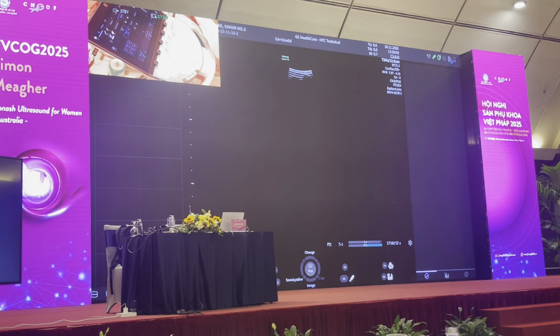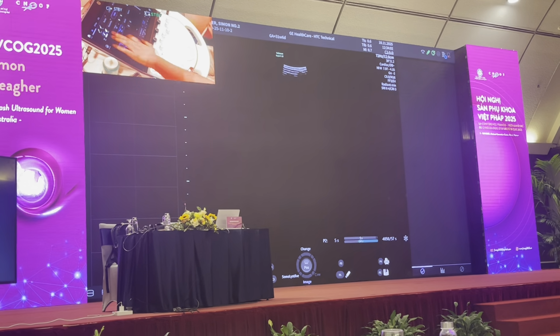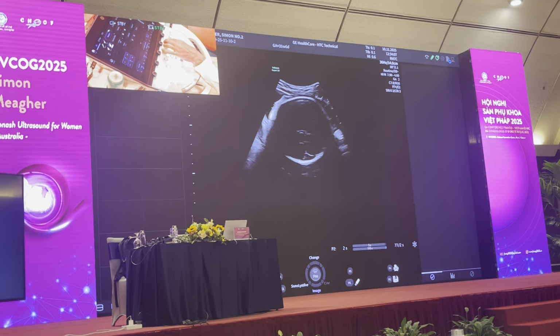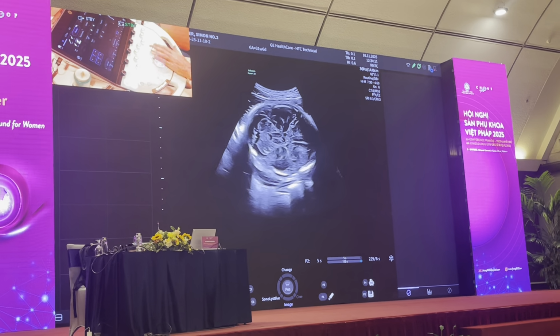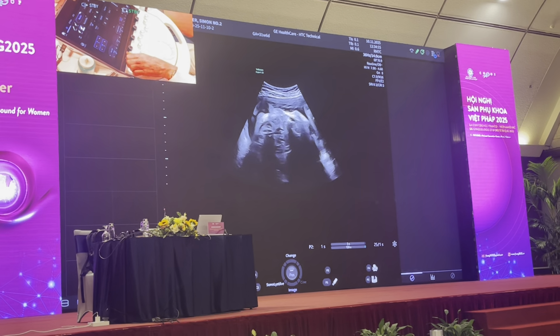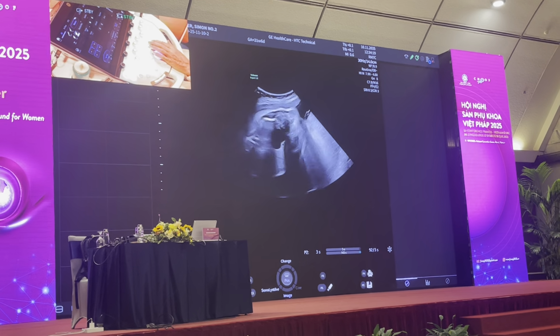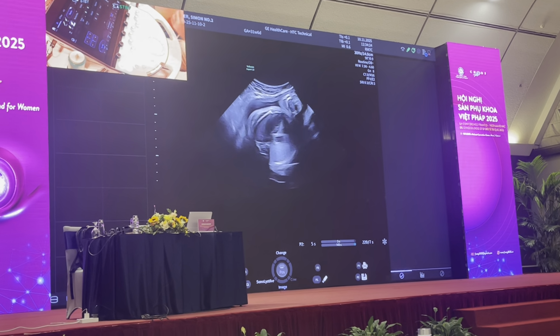So I'm going to start the first procedure, which is a RM7C, which is a patient in the third trimester. I start off the scan and I see the baby in cephalic presentation. I open up my sector width, which is max, and I then sweep up to the baby's bottom, and then I sweep from left to right side, confirming a single live baby on board.